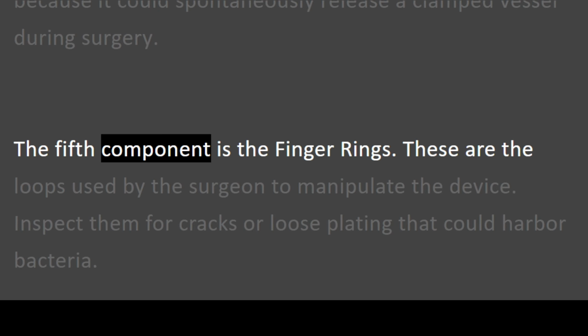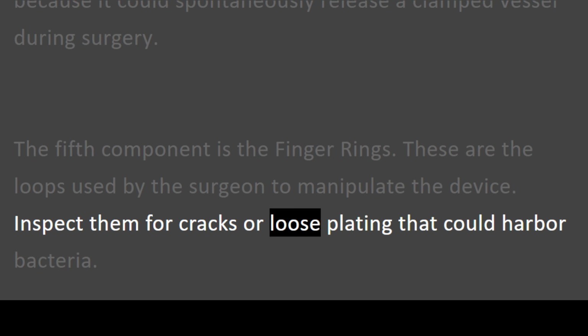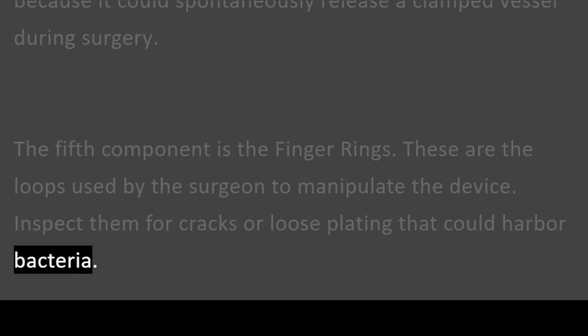The fifth component is the finger rings. These are the loops used by the surgeon to manipulate the device. Inspect them for cracks or loose plating that could harbor bacteria.